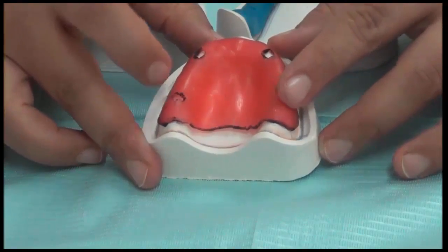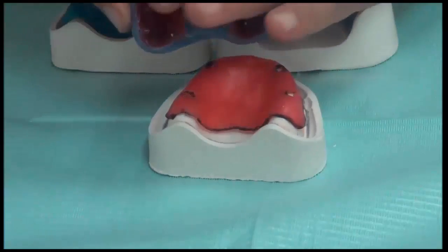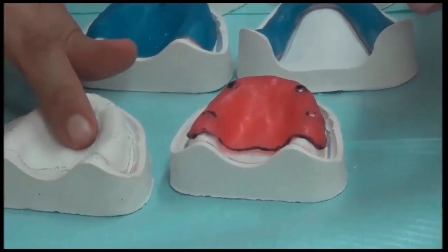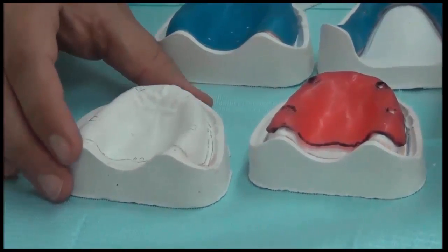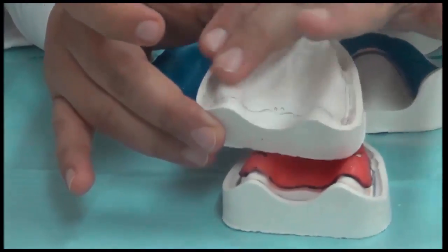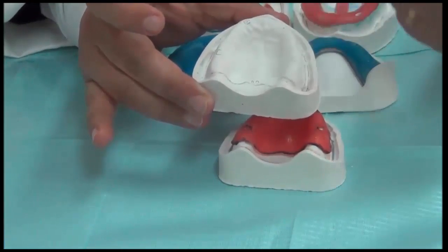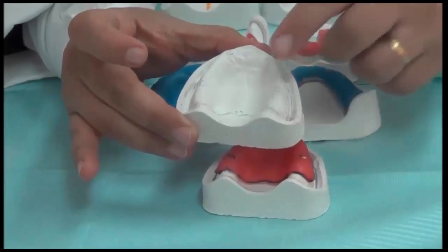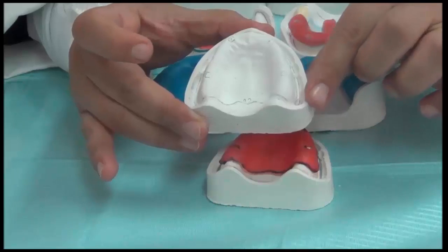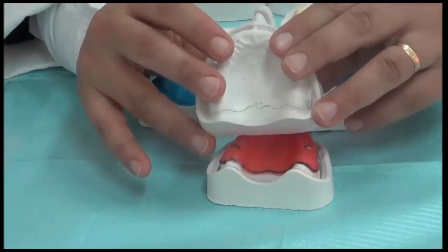So all of the areas covered in wax, once we take out the wax and begin the impression procedure, these areas will all be taken as static. Nothing is compressed or recorded in a compressed status. Once we place the fabricated denture over resting tissue, the denture, as a solid material under occlusal function, will not stay in its place while in function. It will be going in and out by the compressibility of the tissue.